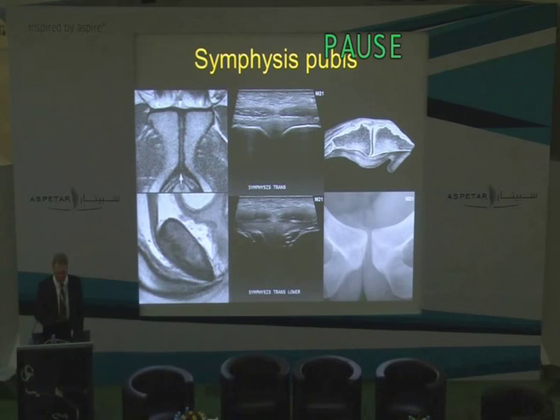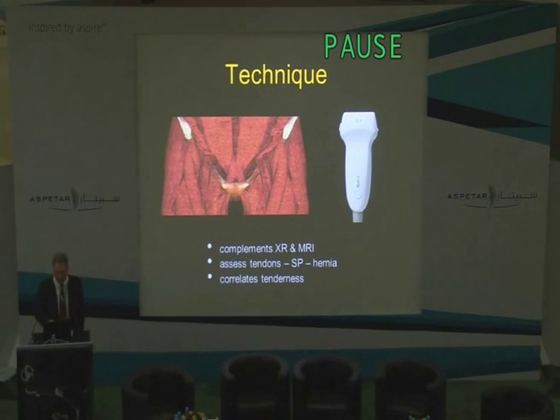Firstly, when I use ultrasound, I don't use it in isolation. I always use it in combination with both plain X-ray and generally with MRI. And I think there is good reason for this. Each of these tests has individual advantages and weaknesses, and they are complementary to one another.